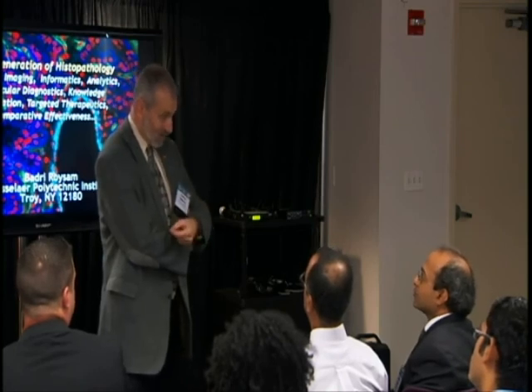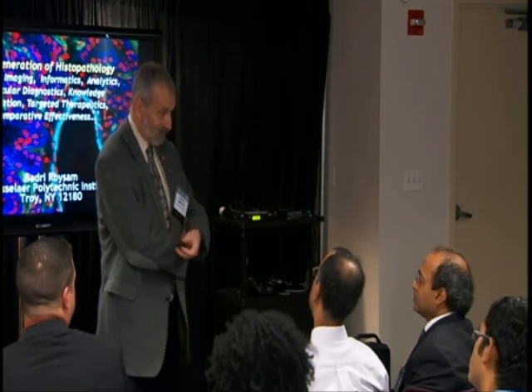So we know at least that is the signal of melanin. We still need to confirm that what we're seeing in the in vivo samples is really melanin, but it has the same excitation spectrum, the same wavelength spectrum, and the same stepwise characteristic. That is, we can excite it with both the CW and pulsed laser. So the probability is very high, but we do indeed need to confirm that. Okay. Good question.